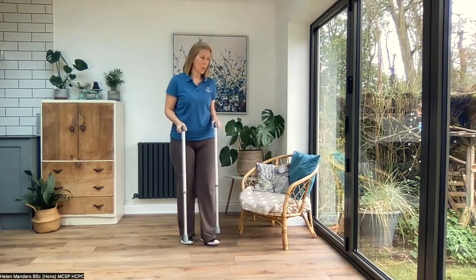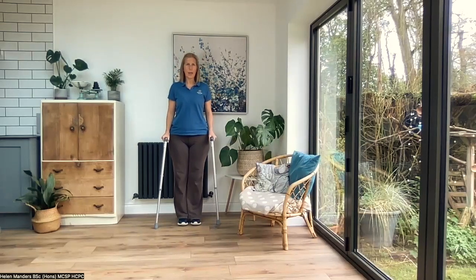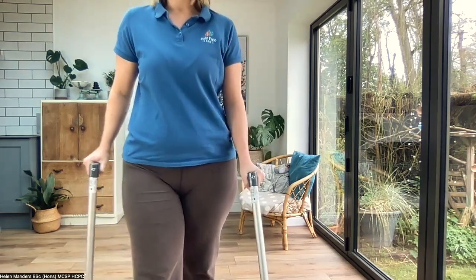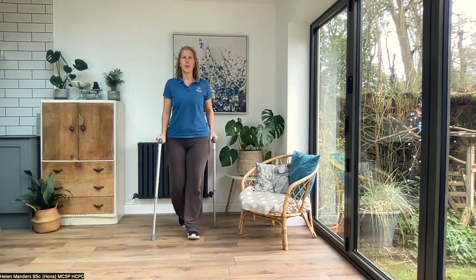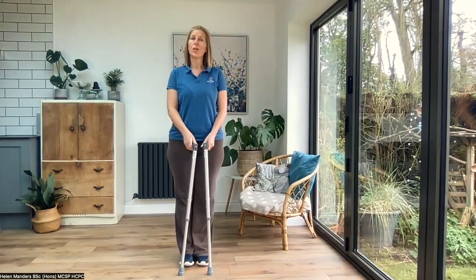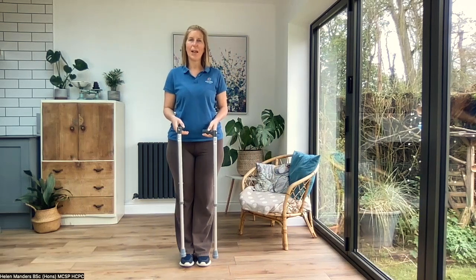If you're then wanting to progress your walking pattern further, you can try this. Now this is as close as we can get to a normal walking pattern, and that's always useful to aim for. So with this one, we're going to move opposite arm and opposite leg, a bit like you're marching. I'll show you that again. So marching. Fantastic. Again, that's the progression of the two sticks together. It's a more normal walking pattern. We're getting a little bit more weight through there. Have a go at that.